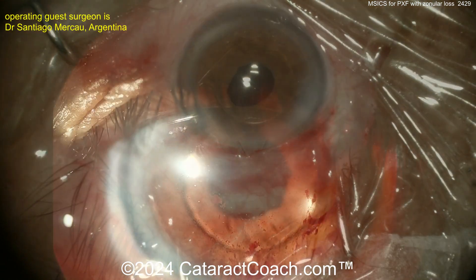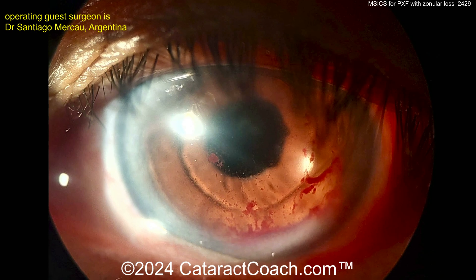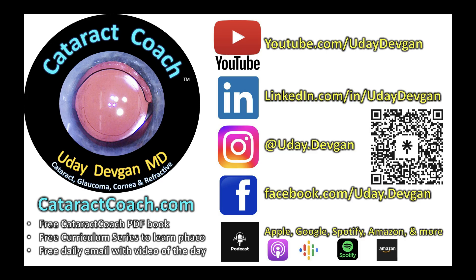Look — a round pupil, meaning you don't have any iris bulged up against the footplates of the AC IOL. Beautiful result. Here's post-op day one — that'll all clear up and the patient will be very happy. I like this case. Remember, check out our podcast — the top podcast in all of ophthalmology — it'll teach you to be a more successful surgeon.